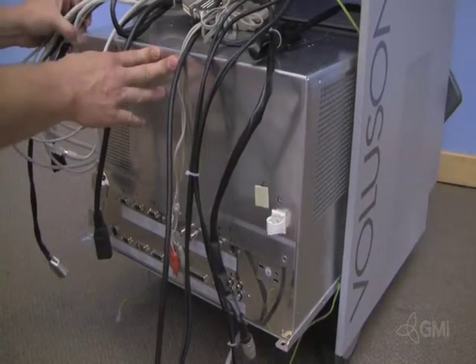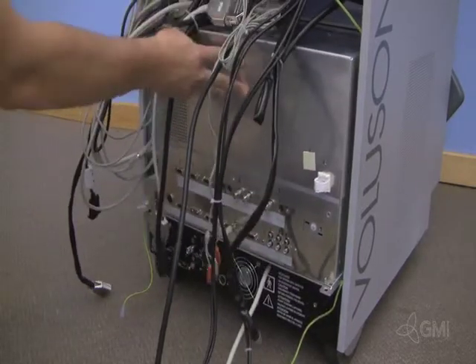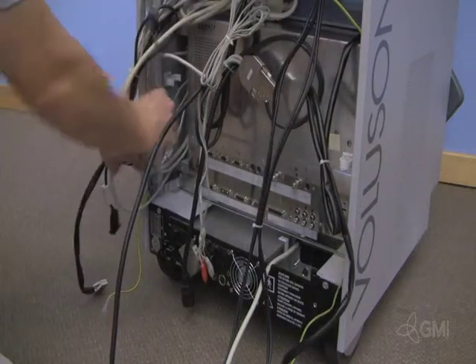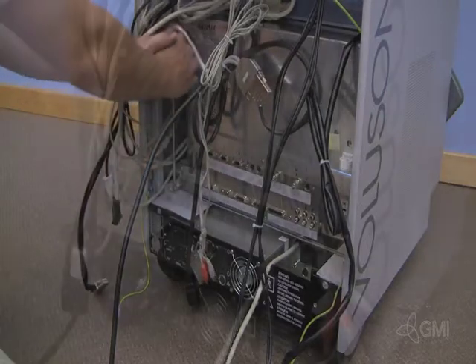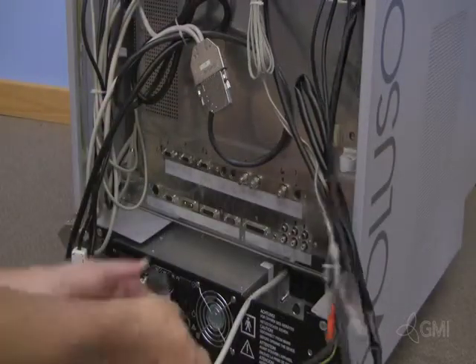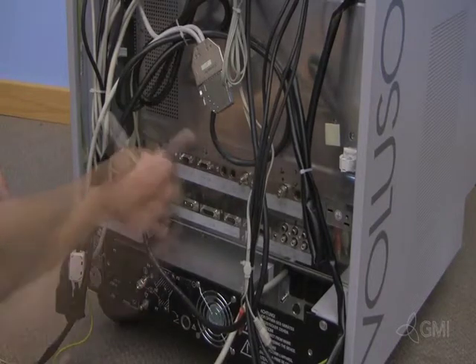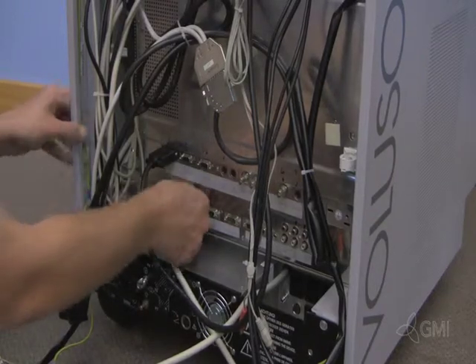Slide the e-box fully into the chassis. Reinstall the two screws to secure the e-box to the chassis. Starting from the left, reinstall all cables to the e-box. Reinstall the two screws to secure the e-box.